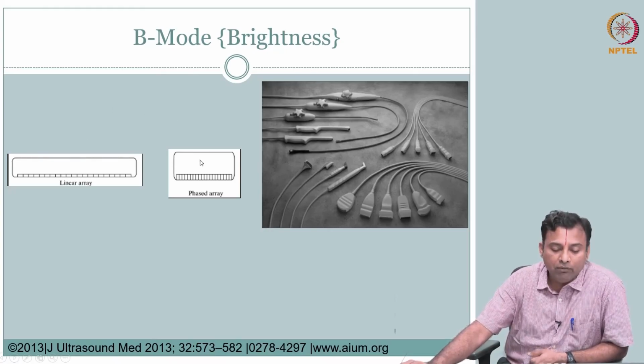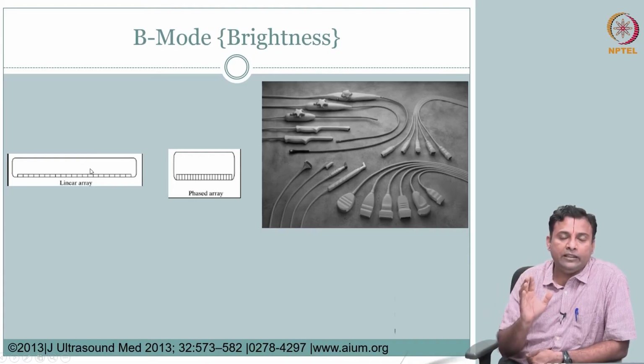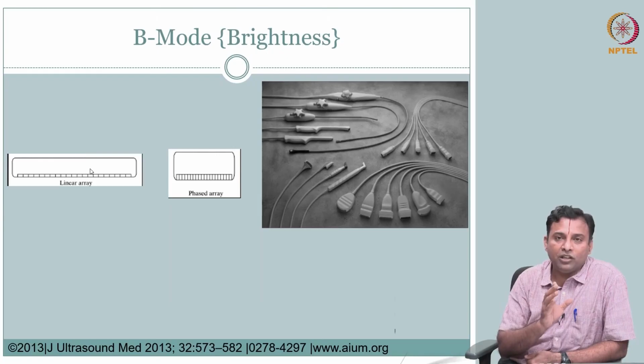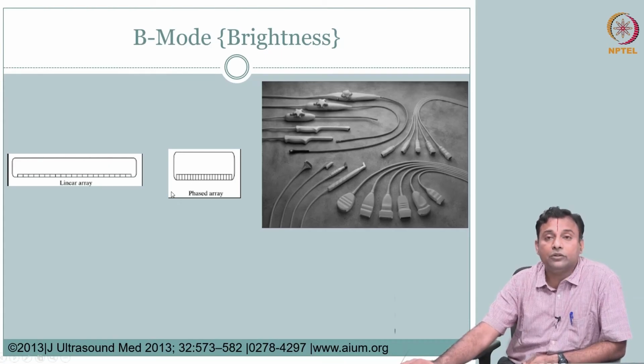What we will cover is the fundamentals, just to get an idea of the subject. We have covered A mode. Instead of mechanically translating or steering it, how do we accomplish the same thing using this transducer array? That is what we will cover.